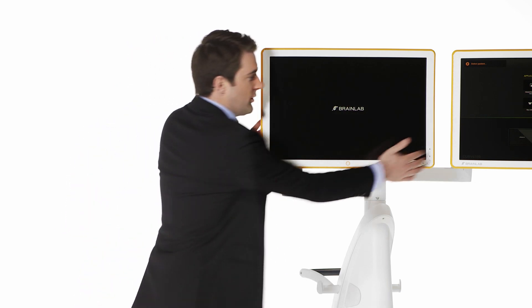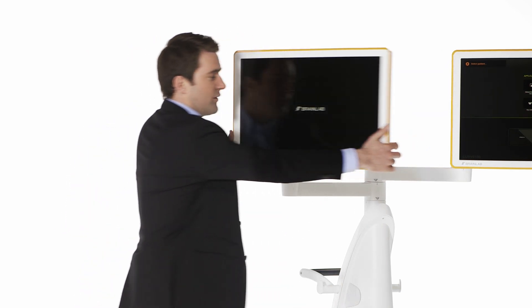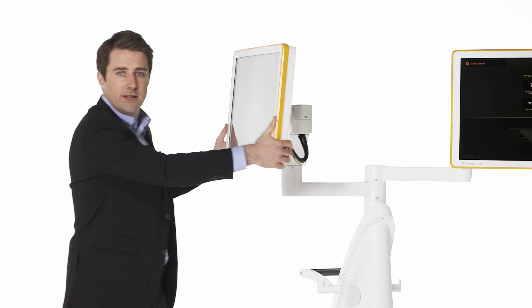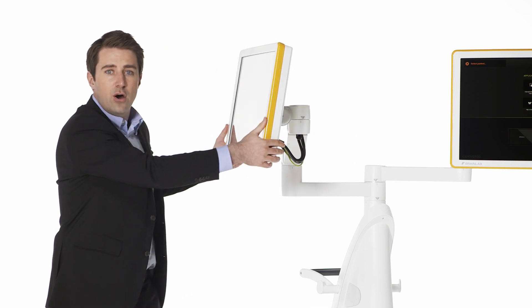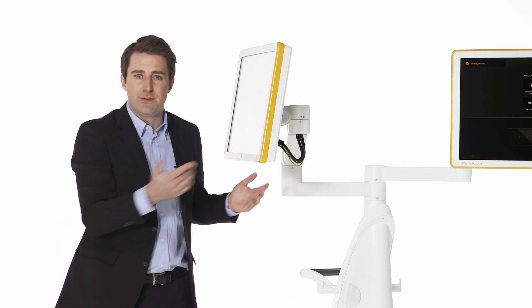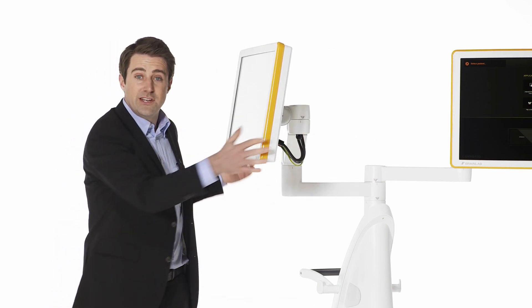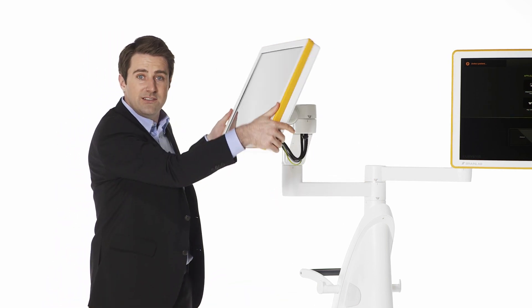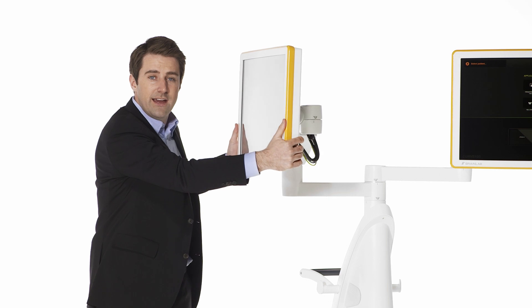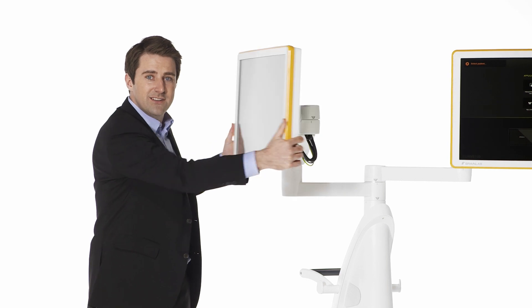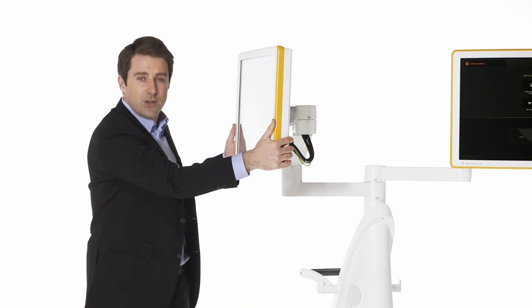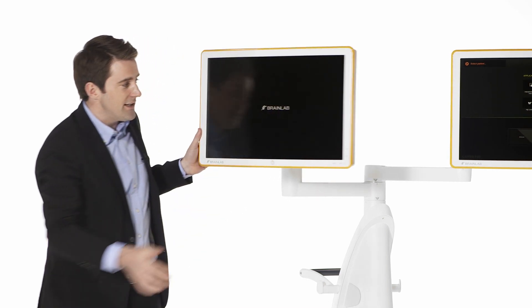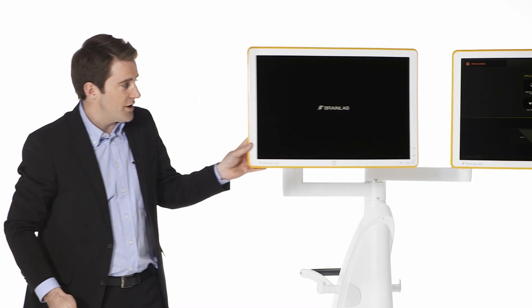The highly adjustable arms of Curve Dual Display allow for optimal viewing position, not only in monitor tilt and rotation, but also in relation to one another.